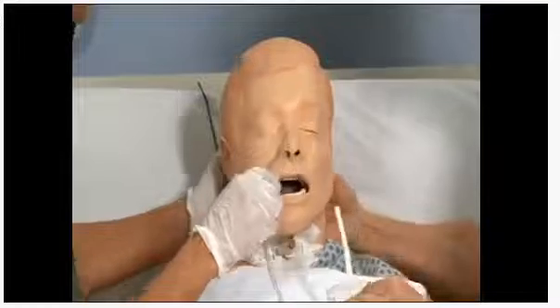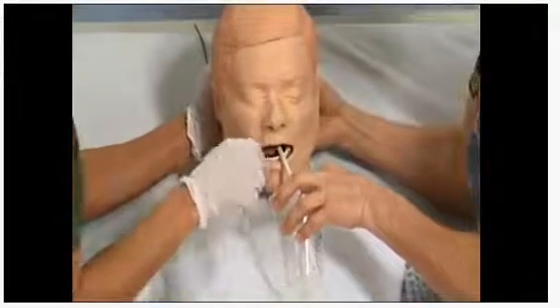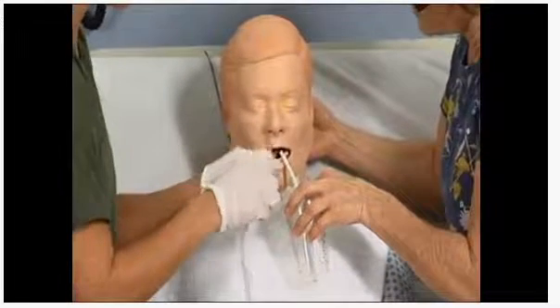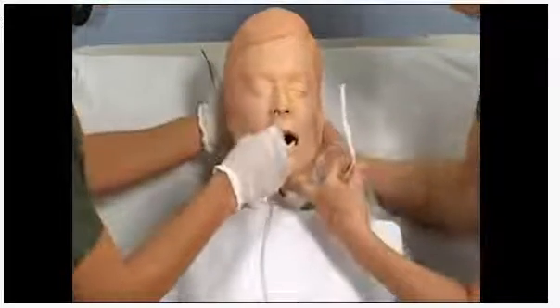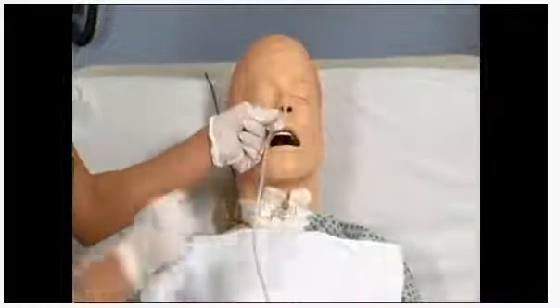All right, Mrs. Jones, are you ready? Chin to the chest. Are you ready? And swallow. And swallow. Very good. Swallow and swallow. That was wonderful. All right, now I've gotten to my marking so I know I can stop.